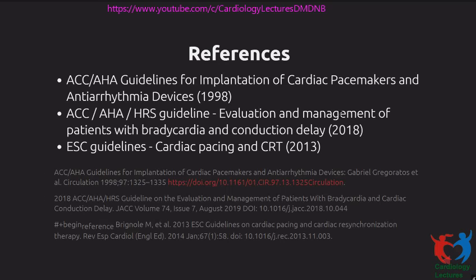Now, the other group of patients are patients with sinus node dysfunction who have intermittent AF, so the paroxysmal AF. So sometimes people are worried about dual chamber, thinking that you might have inappropriate tracking and fast ventricular rates. It's usually not an issue. You can always program around it. All the devices have mode switch on, so you can switch to a non-tracking mode with a set rate threshold. So that is not a reason to be worried about a dual chamber pacemaker.